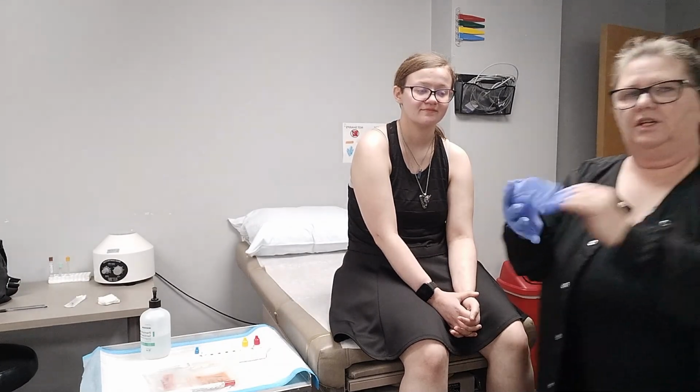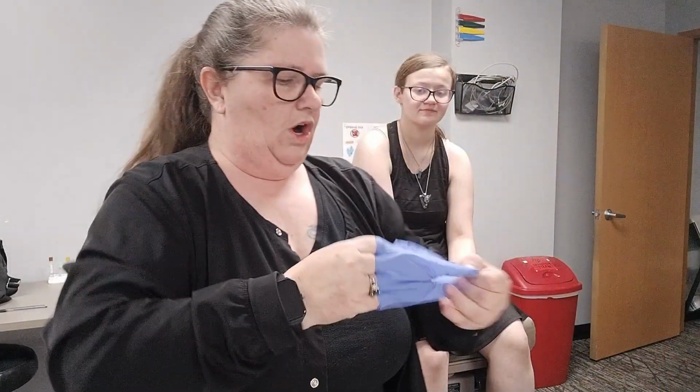You'll remove your gloves, wash your hands, and dispose of everything. And that's it. Thank you so much.